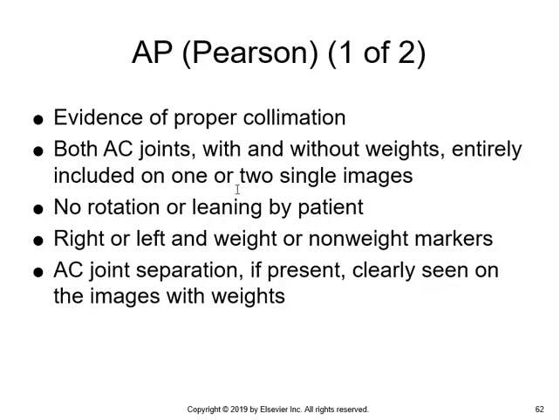Have the patient hold their breath before you make the image. You don't want any kind of rotation or have the patient leaning, which is going to be a tendency. If their shoulder hurts, they're going to have a tendency to slouch. Just, again, educate your patient and make sure that they don't slouch.